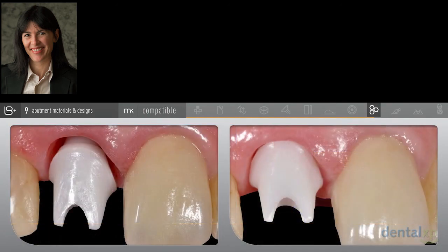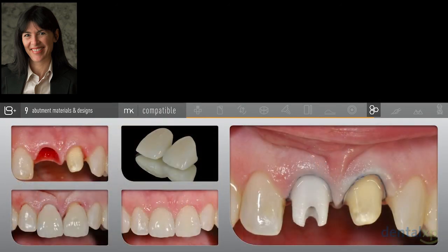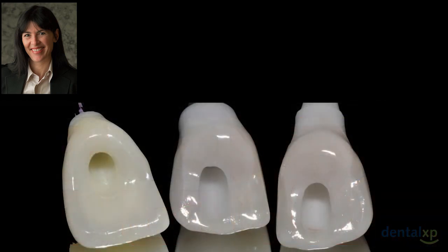So when we design abutments, they are almost equigingival today. The cement line is in the most accessible position possible in order to reduce the biologic consequences of trapping. It allows the restoring dentist to think about the abutment the same way as they deal with teeth, right? You don't want margins buried miles underneath tissue. You want them in accessible areas. Well, as a periodontist, it also forces me as much as I can today to think about, can I avoid cementation? Can I think about screw retention?